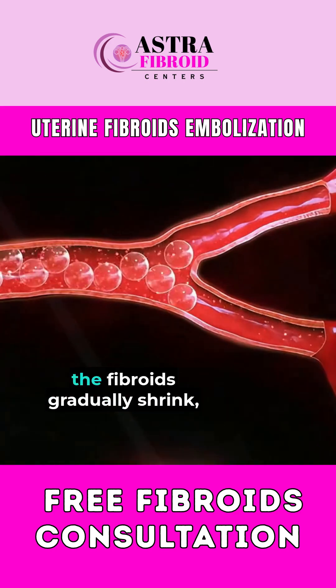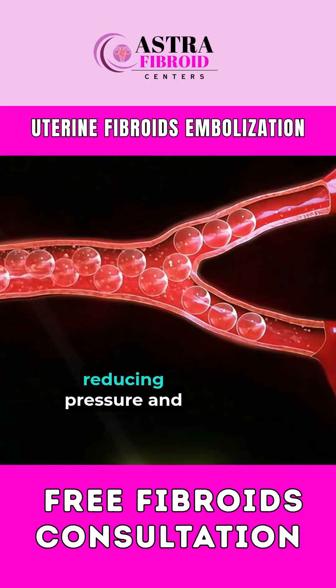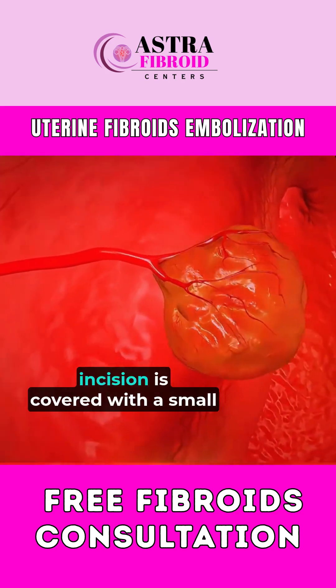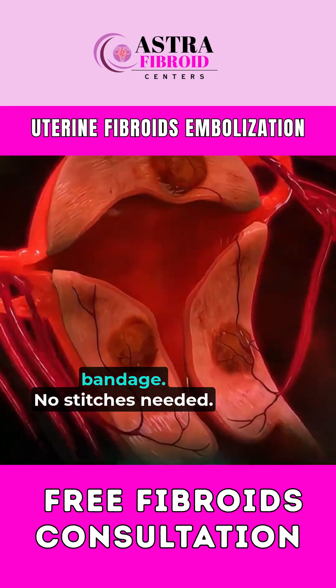Without a steady blood flow, the fibroids gradually shrink, reducing pressure and discomfort. After the procedure, the catheter is removed and the incision is covered with a small bandage. No stitches needed.